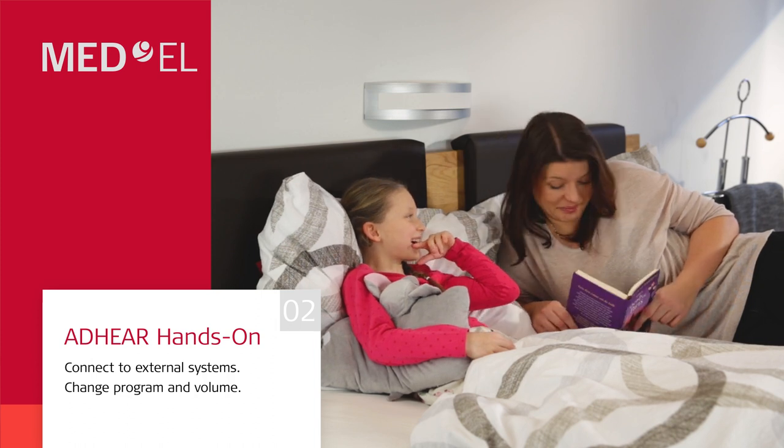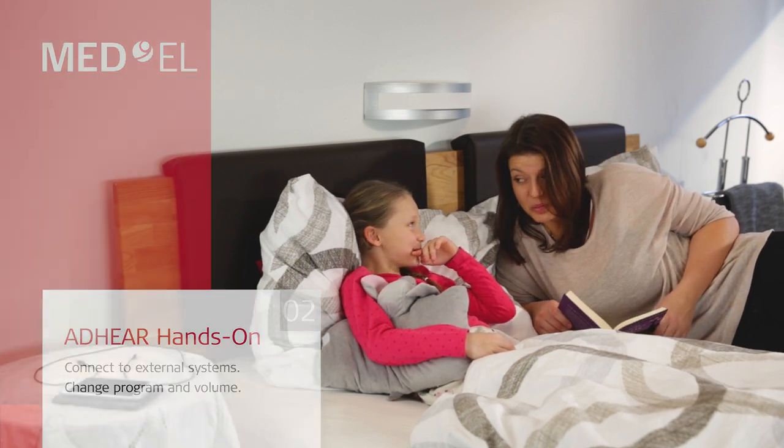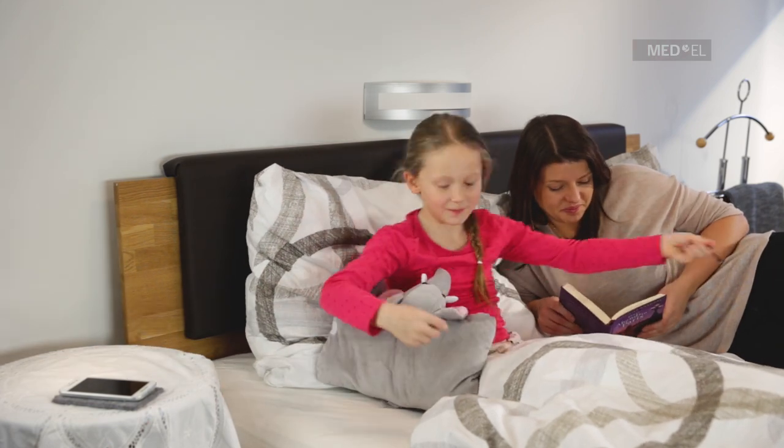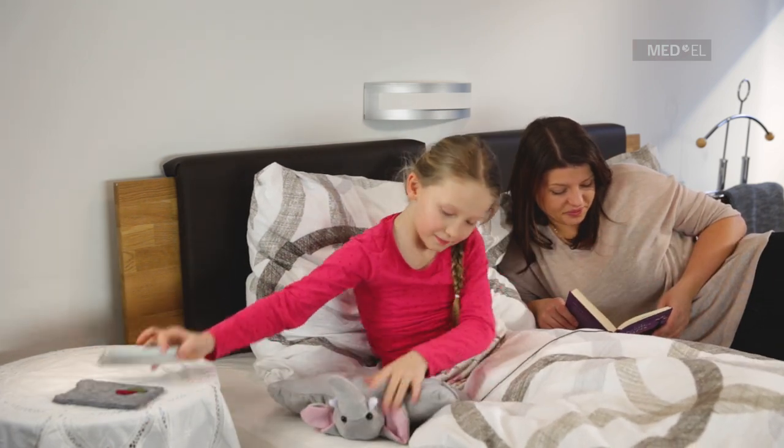Adhere can be connected to different external devices, such as FM systems, telecoil receivers, or smartphones. Appropriate cables can be ordered.